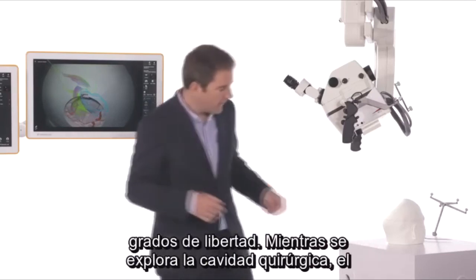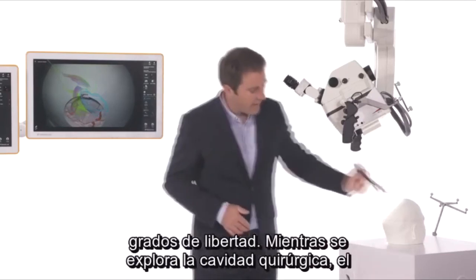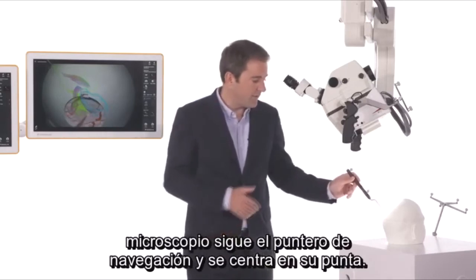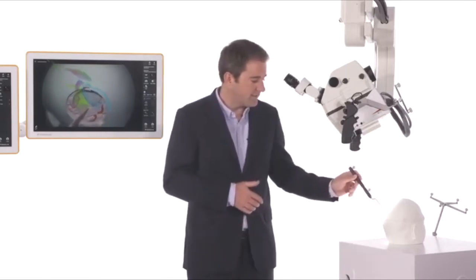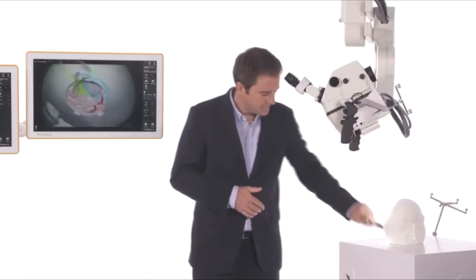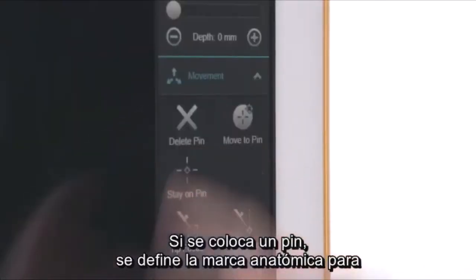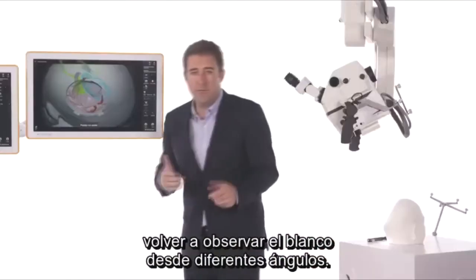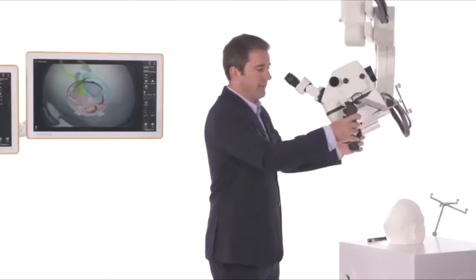While exploring the surgical cavity, the microscope follows the navigation pointer and focuses on its tip. Setting a pin defines a landmark to return to for observation of the target from different angles.